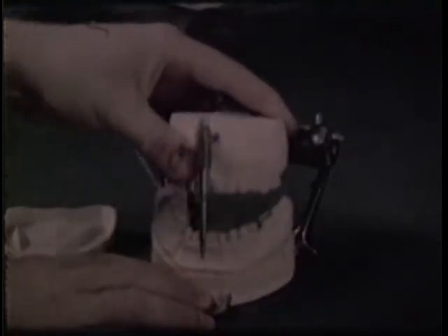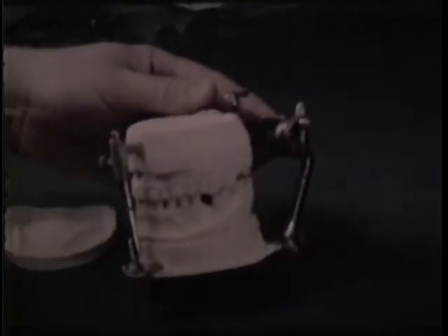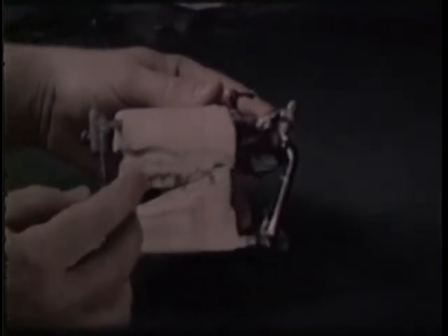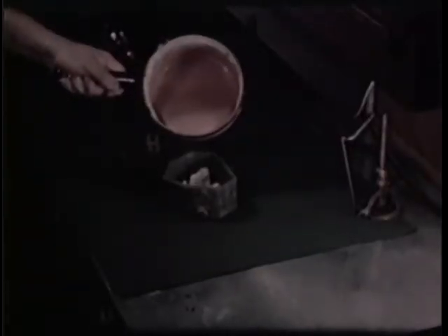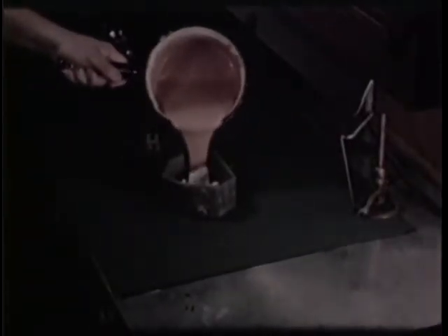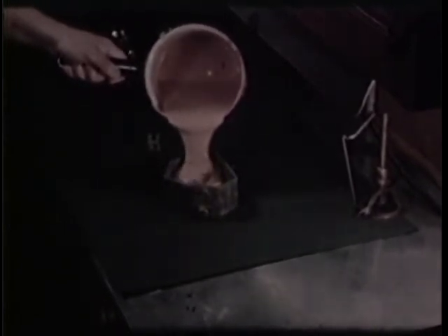Preliminary to actual casting, the models are assembled on an index base in the relationship previously established. As a precaution, the model is duplicated in refractory material before casting. Ordinary DP model reproducing material is used, following standard practice, to make the mold.